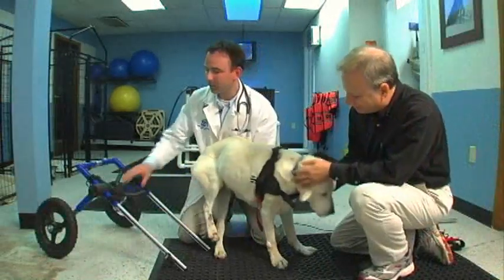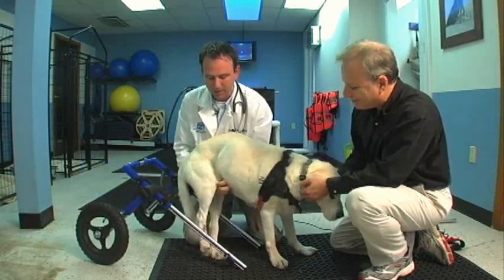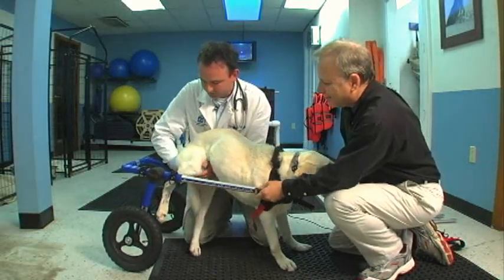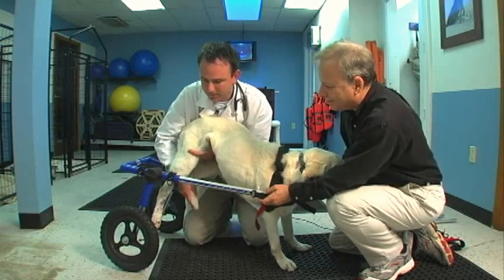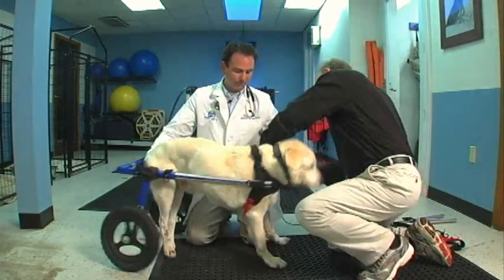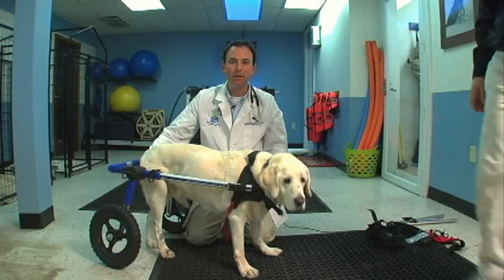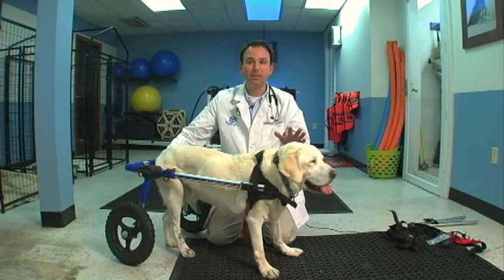One of the other ways would be to have the leg rings already attached and then lift Sonny's hind end into the leg rings. So what we're going to do is bring the cart up along the sides. Mark's going to hold the front end, and I'm going to pick Sonny's legs up. Sonny's got a stiff back leg there. And I'm going to set him right down into the cart like that. Like I said before, you're going to find your own way. And even in my practice now, I do it all on my own, and I have my own kind of style in terms of getting the dog into the cart. So don't be intimidated by any way.